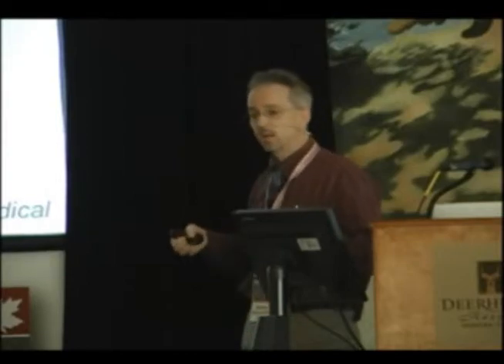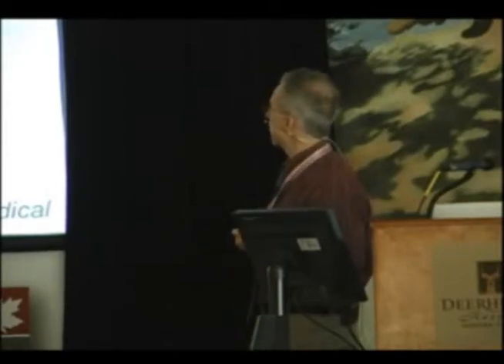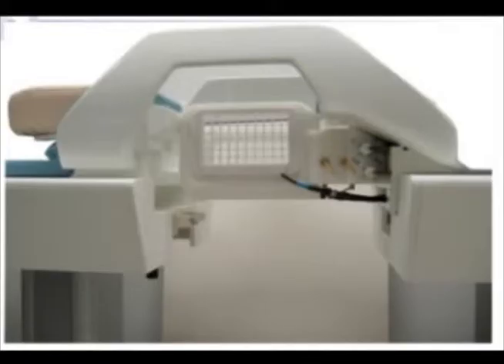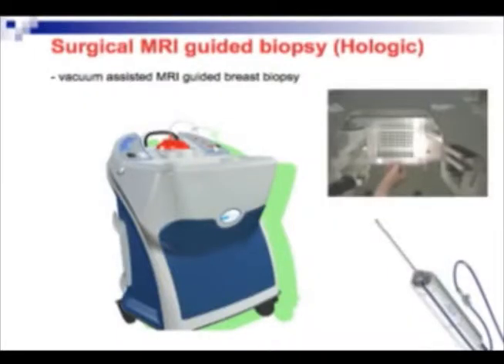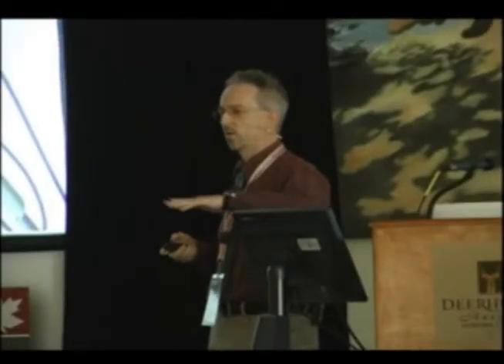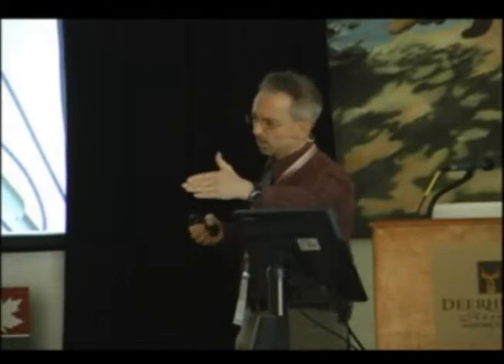So when you get the information about the tumor, you can put a biopsy needle in, and you've got access to the breast laterally and medially as well if you need it. You can put a biopsy gun in there, use vacuum-assisted biopsy like one of these devices by Hologic, and you can take out whatever part of the tumor and then put the woman back and forth in the magnet, back and forth all the time to see, did we get the biopsy or we didn't?